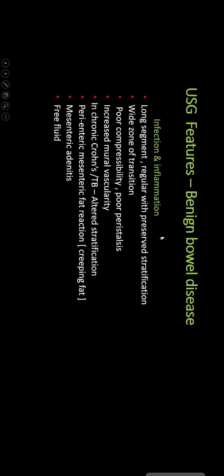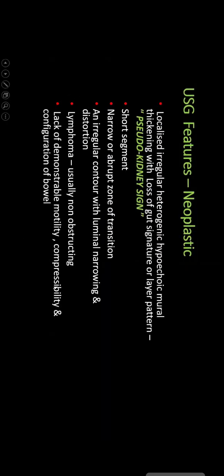So I will not repeat the bowel findings in infection and inflammation. So these are neoplastic pathologies. Now let us have a couple of interesting unknown cases. Please guess yourself and try to diagnose them. Please give me one minute.